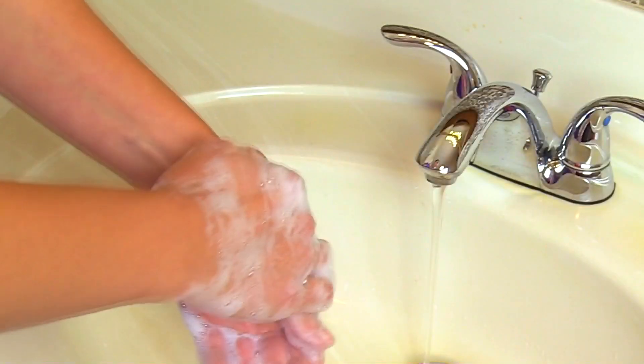Of course, perform hand hygiene before beginning. To check the temperature in the infant we're going to check it via the axillary route. We're going to place a thermometer tip in the armpit of the infant, and I've already placed a little protective sheath over the thermometer.